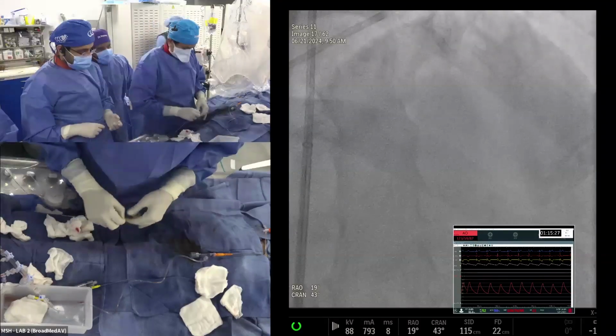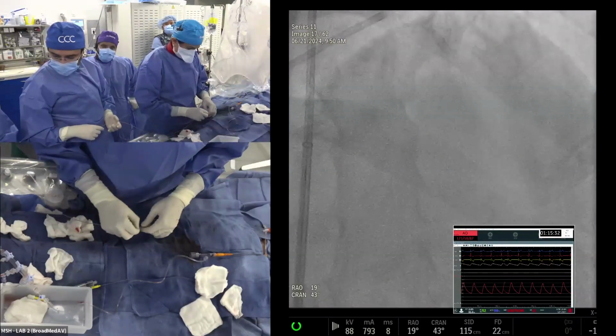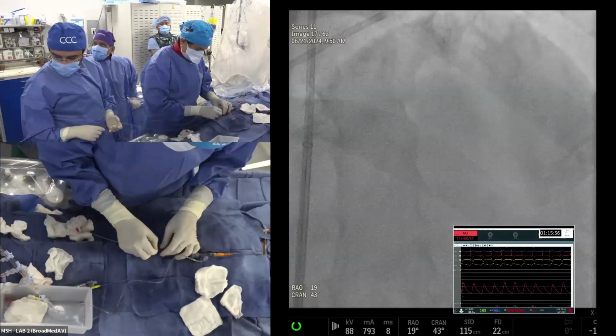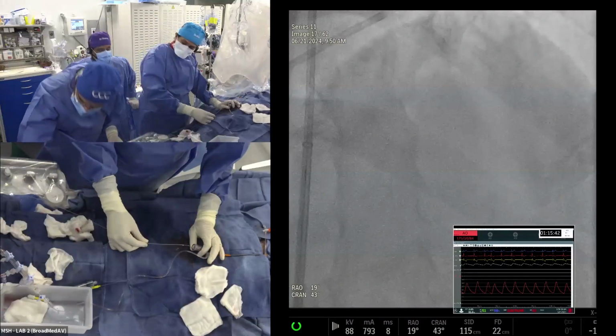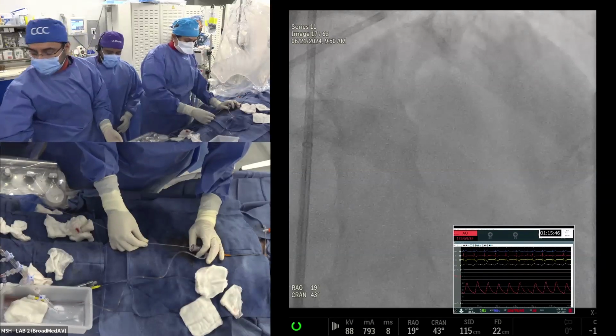Saturday morning. Okay, so this is a 1.5 burr. Another vote for the provisional strategy. So good, I think that has been our goal also. Let's see how much we succeed, but we should get a 2.5 cutting balloon and then we'll see. Let's get the burr first. Okay, good.